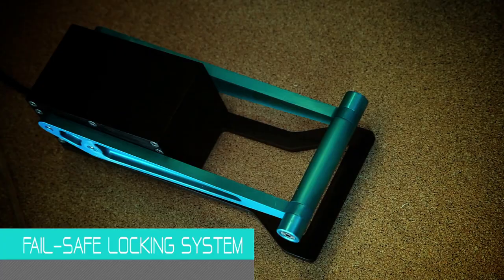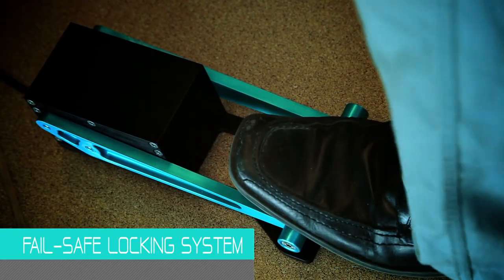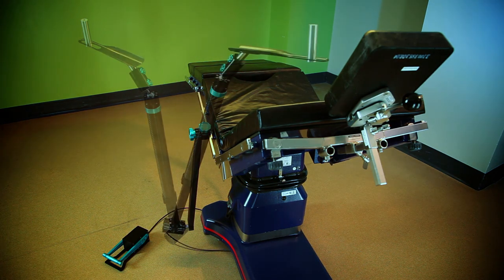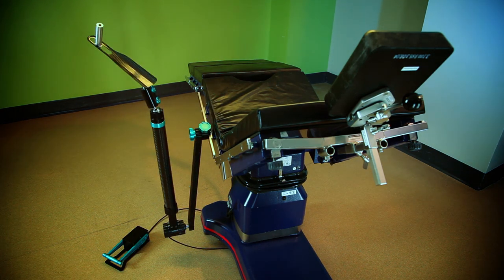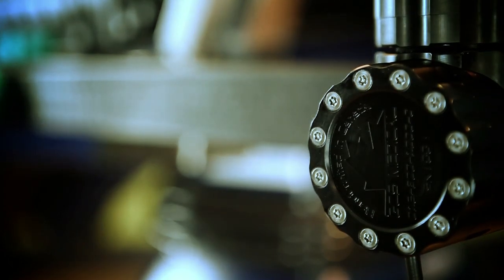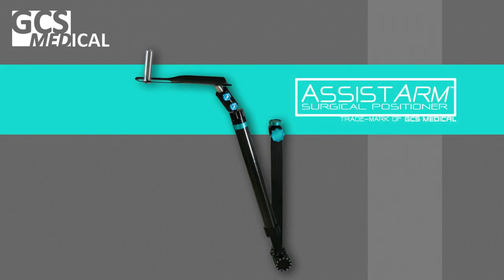It provides exceptional control while the pedal-operated fail-safe locking system steadily maintains the limb in position without obstructing the surgeon's workspace. With the Assist Arm, the GCS Medical team is proud to redefine shoulder surgery. Contact the GCS Medical team for a free trial of the Assist Arm.